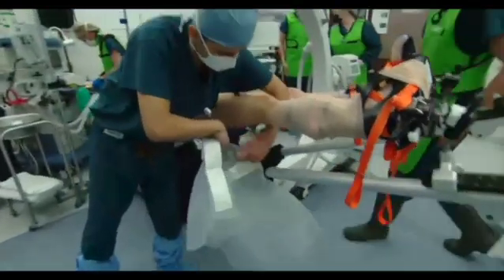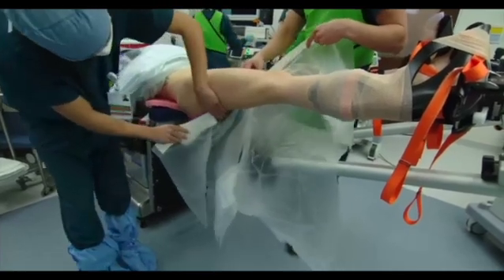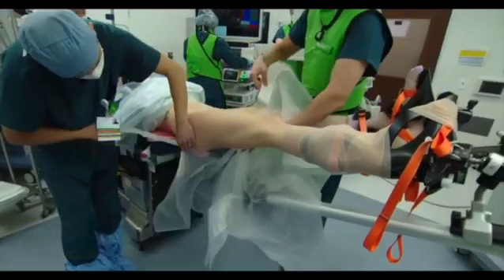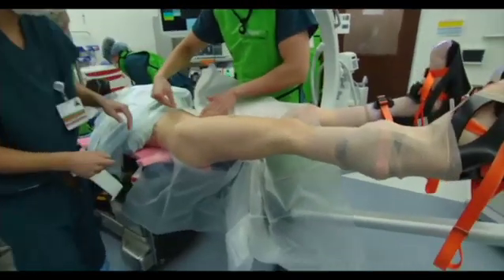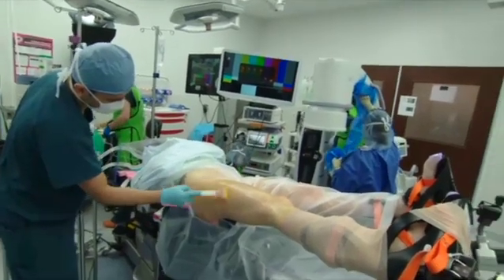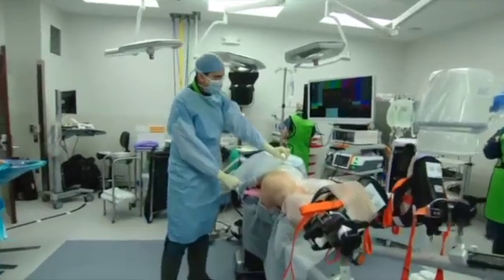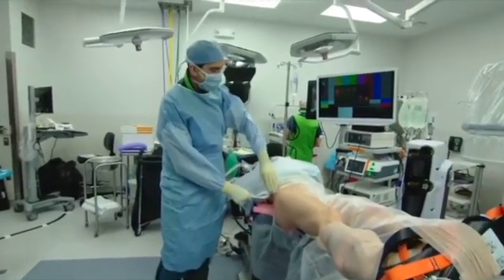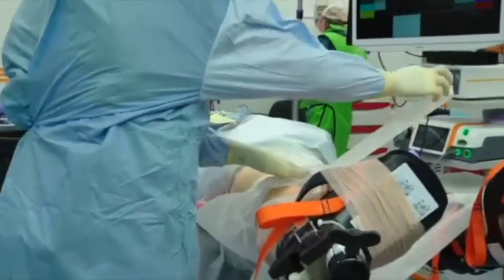After fluoroscopic confirmation of the desired 8-10 mm joint distraction, a u-drape is positioned allowing adequate surgical side exposure. The open section of the u-drape is positioned facing cephalad, while the lateral vertical edge of the u-drape should be attached to the skin at the edge of its junction with the surgical table, and the medial vertical portion to the proximal and medial-most aspect of the patient's thigh. After scrubbing the surgical limb, four 10x10-inch sterile drapes are placed on the inside surface of the previously positioned u-drape to establish sterile boundaries.